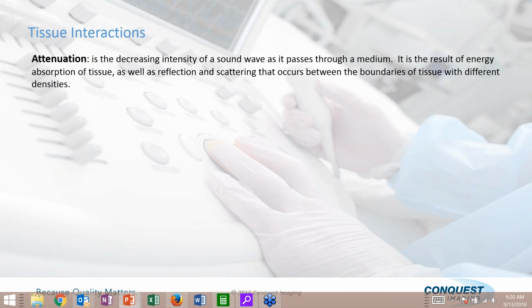Attenuation. As ultrasound goes through the body, it is attenuated, or it breaks down. It weakens. And that's just a natural function of the ultrasound beam. And there's absolutely nothing we can do about it. That's something that we factor in when we process the ultrasound beams coming back.